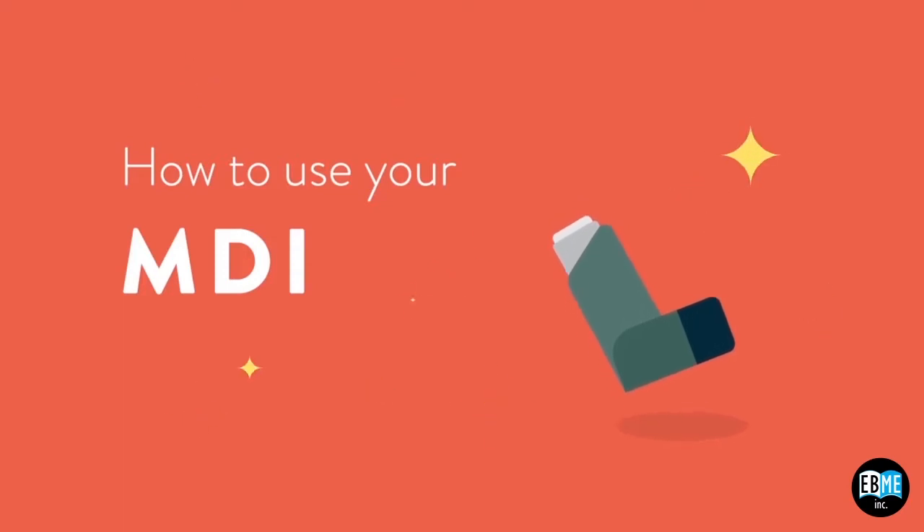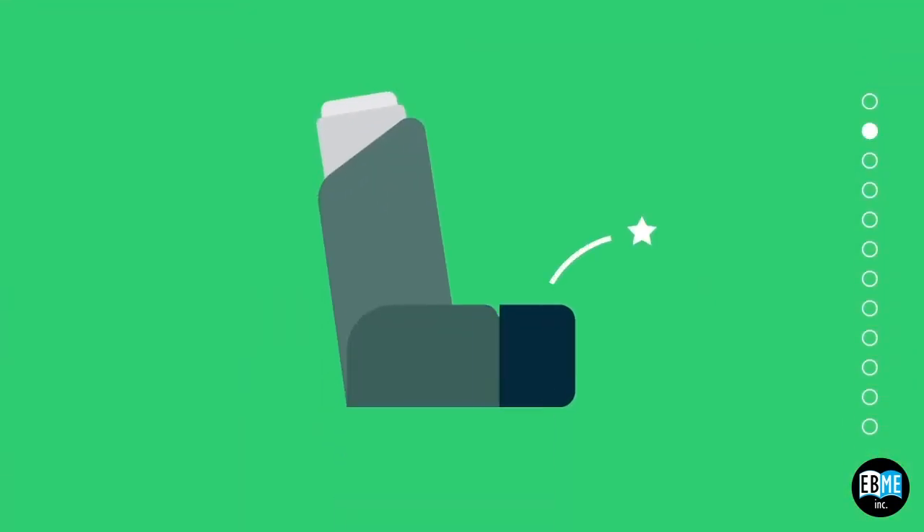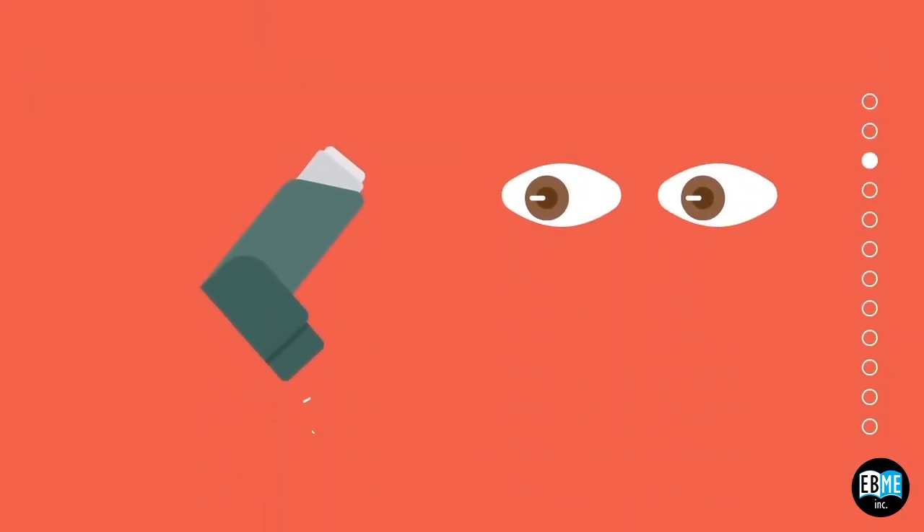If you are not using your MDI with a spacer, this is how to use your MDI. Sit or stand up straight. Remove the cap from the mouthpiece of your inhaler. Check for and remove any lint or object in your inhaler.